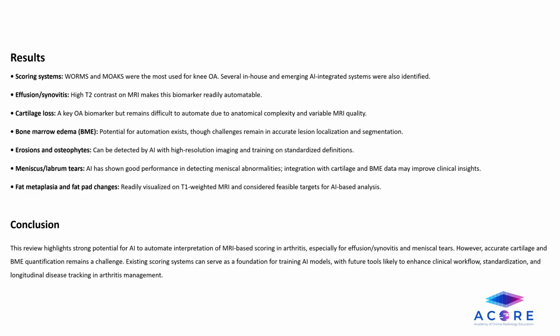Potential for automation does exist for bone marrow edema. The challenges remain in accurate lesion localization and segmentation. Erosions and osteophytes can of course be detected by AI with high-resolution imaging and can be trained on standardized definitions when using these different AI models. And AI has also shown really good performance in detecting meniscal abnormalities, and integration with cartilage and bone marrow edema data may help to improve clinical insights from this end. And fat metaplasia and fat pad changes are readily visualized on T1 weighted MRI, and they're both considered feasible targets for AI-based analysis.